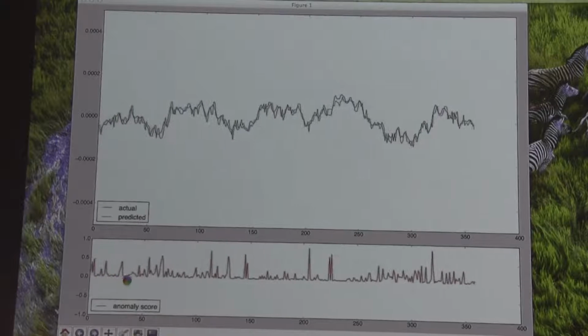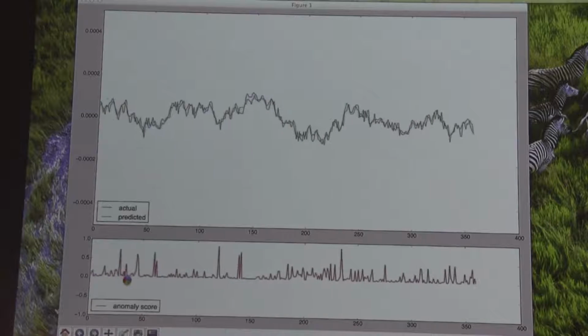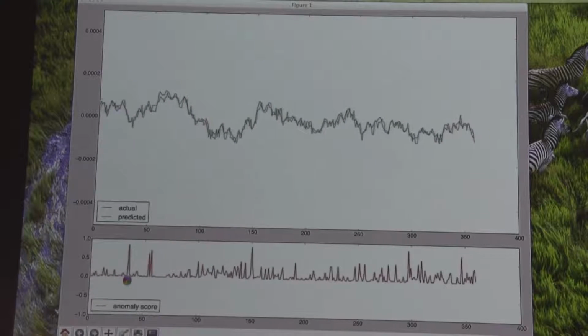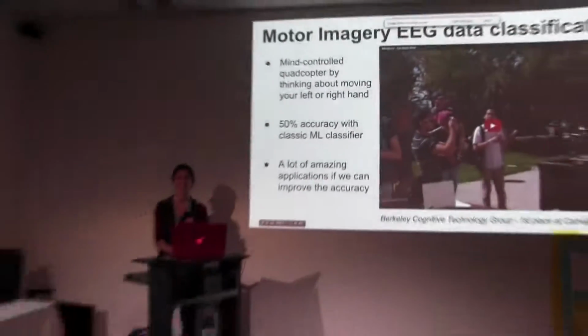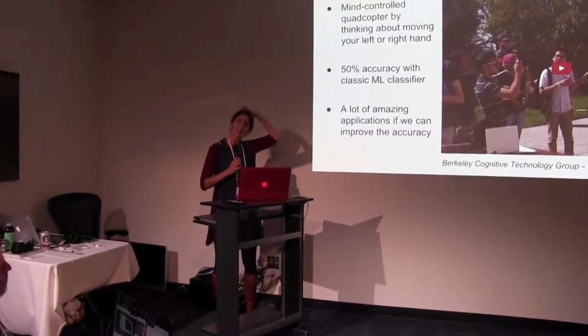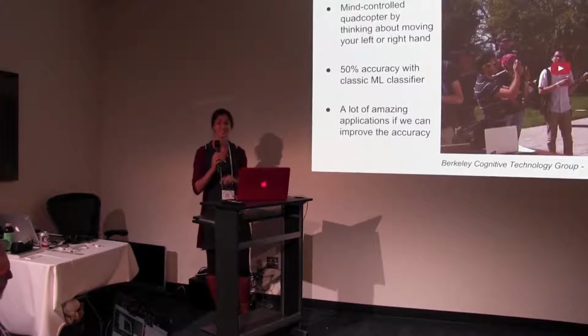And then after that, each time I get an incoming EEG signal, I take just a little chunk of 400 milliseconds and I feed it. And then it's giving me this result. Yeah, that's really cool. Nice. We've been talking about doing classification using anomaly models like this for a long time, and I think this is the first time we've actually seen it work, right? We've seen that from the community.